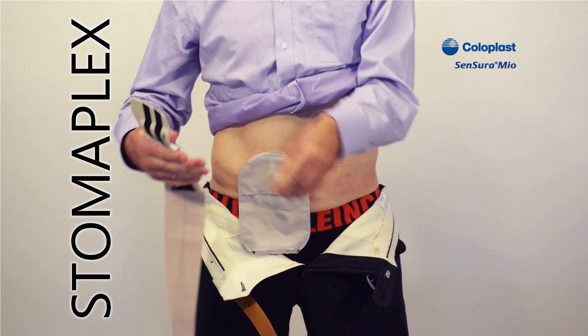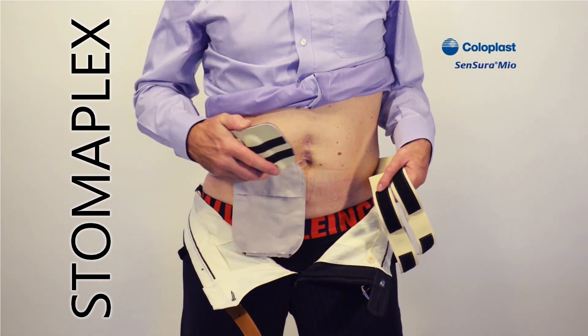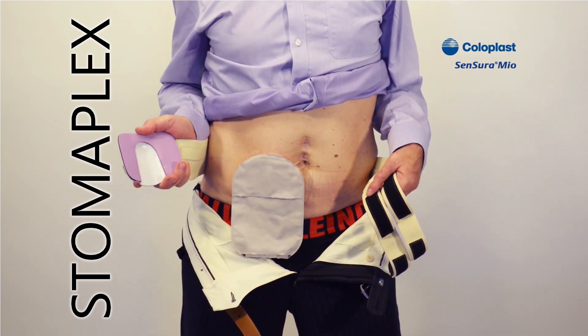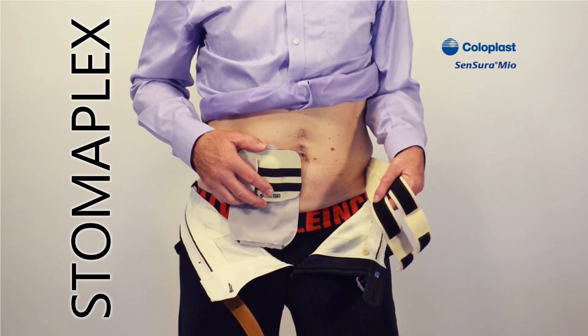Now what you need to do is bring the belt around to the back and to the front, and then make sure that the center of the guard is lined up over your ostomy. The inside of the pad will apply pressure right onto the plastic ring of your appliance, so just place it over the top of your pouch.